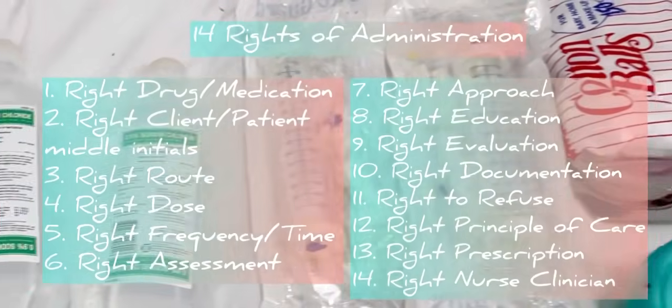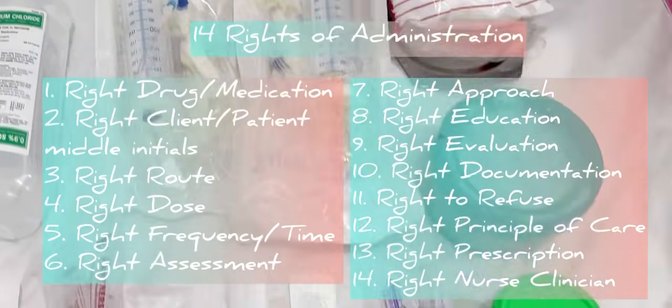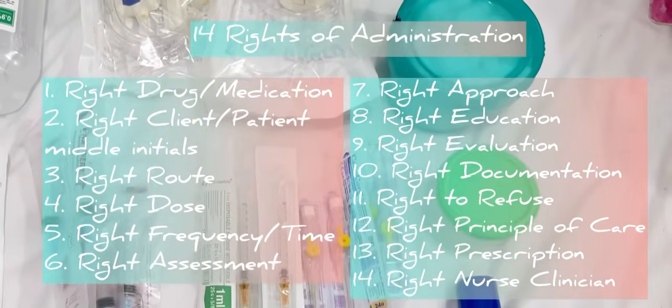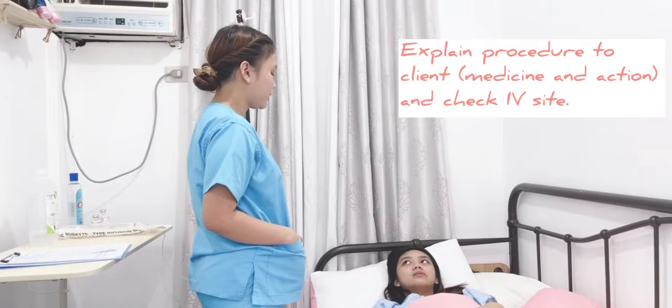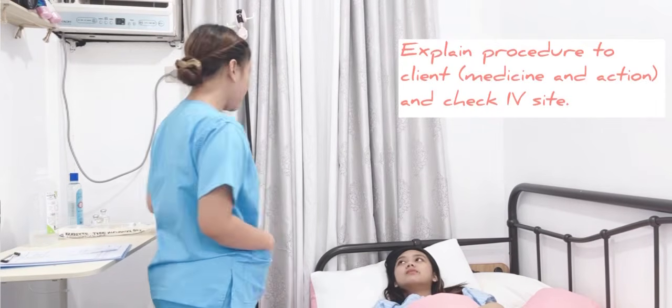Then observe for the 14 rights of drug administration while preparing and administering medications. Then explain procedure to the client, which includes medicine and action, and check IV site.